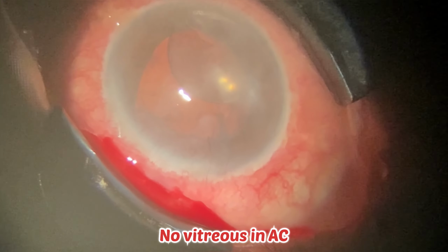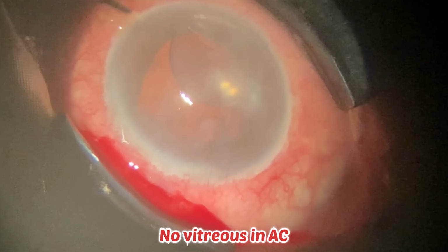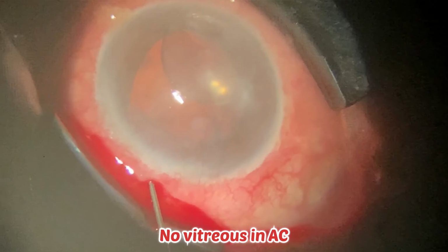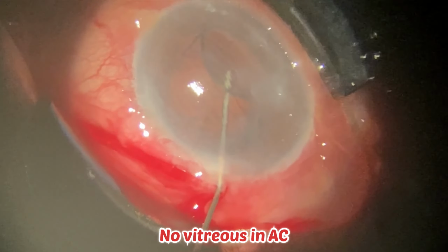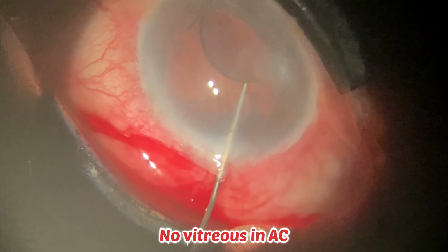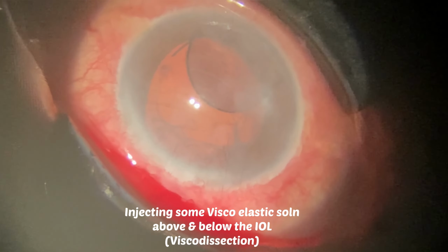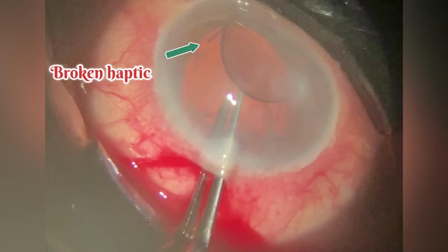I am planning to cut the IOL and take it out through the 2.8 mm incision. So how to go about it? Can I cut it into 2 pieces or should I cut it into 3 pieces? I am planning to cut it into 3 pieces, so I am injecting some viscoelastic solution above and below the intraocular lens.